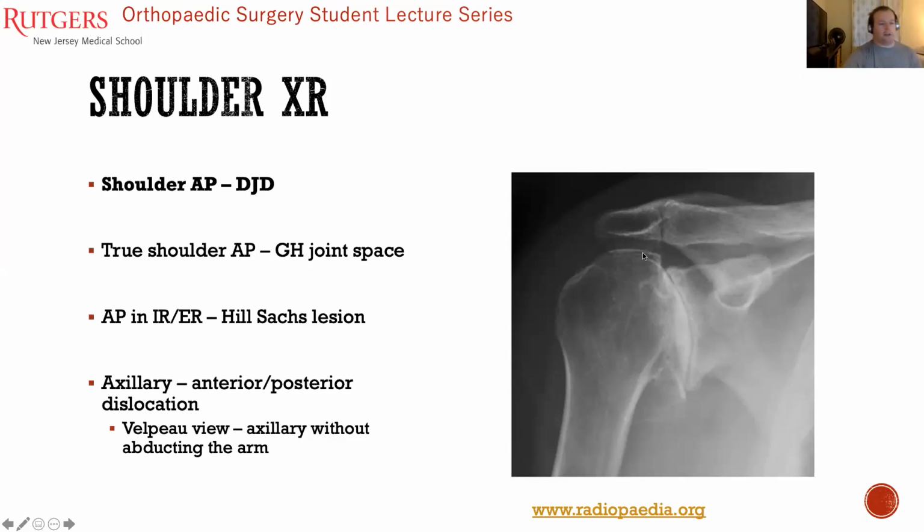Again, when you think about that, you're going to lose the normal articulation of the shoulder itself, which will start causing edge loading, causing degeneration of the shoulder. You'll start to see these inferior osteophytes, which are a hallmark of rotator cuff arthropathy leading to arthritis. But that's something to really keep an eye out for: if you see the humerus starting to slowly ride up, there's likely no longer tissue in the subacromial space, the rotator cuff. And that's something else you have to consider when you're talking about treatment options down the road for this patient with arthritis.